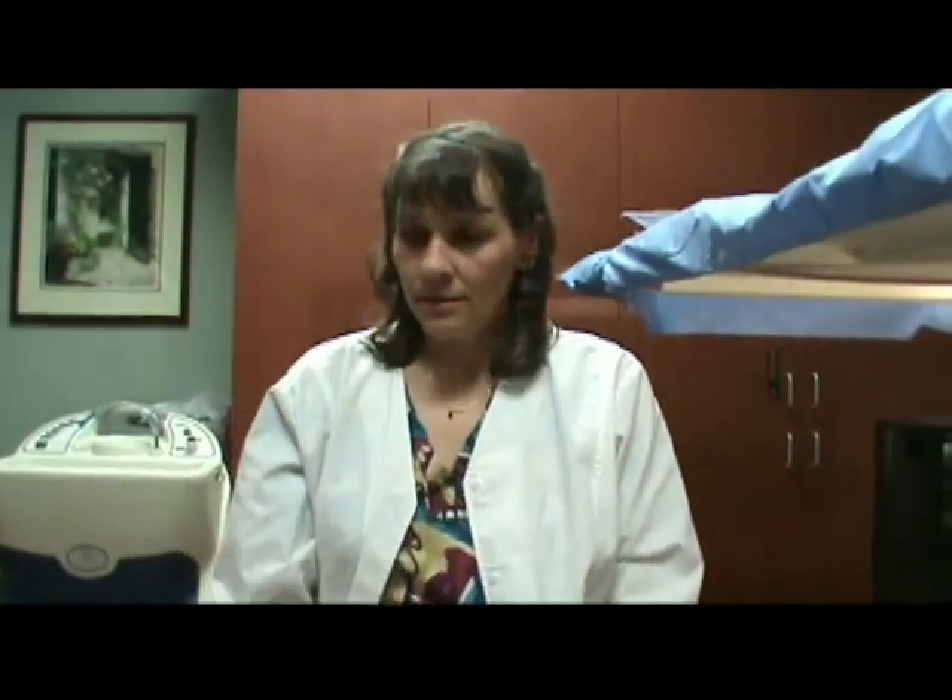This concludes the installation video for the LS702. If you have any questions, please contact us at www.qsim.net or our toll-free number 877-304-4446. Thank you.